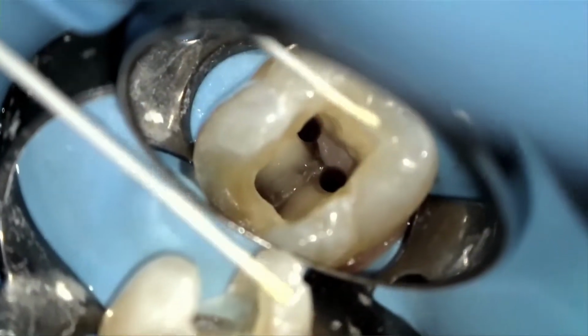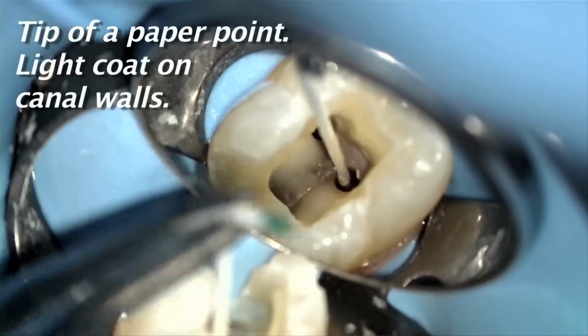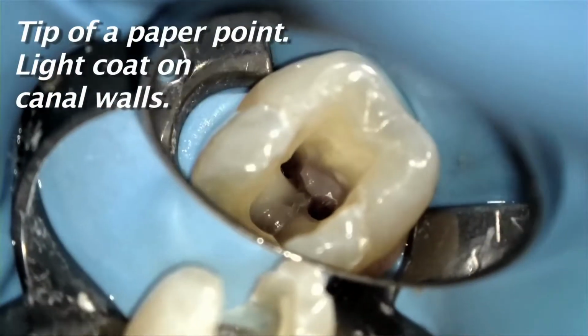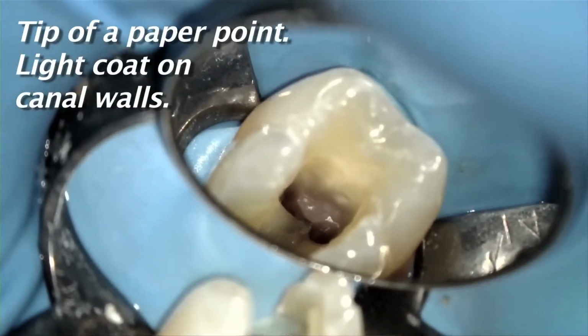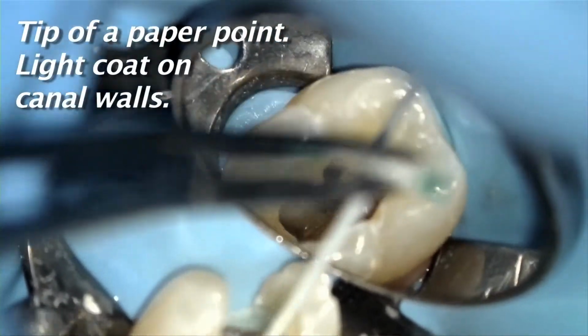When it comes to sealer use, please use very little. As you can see in the clinical video, for an average sized canal, simply use enough sealer to cover the tip of a paper point. That's it. In a larger canal, of course, you'll need a bit more, but not much more.